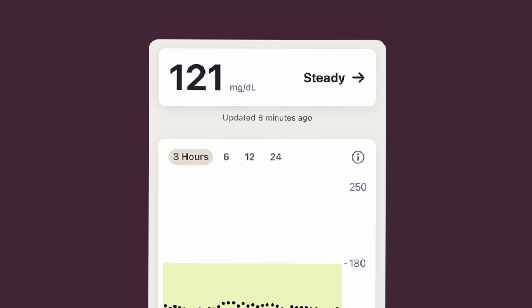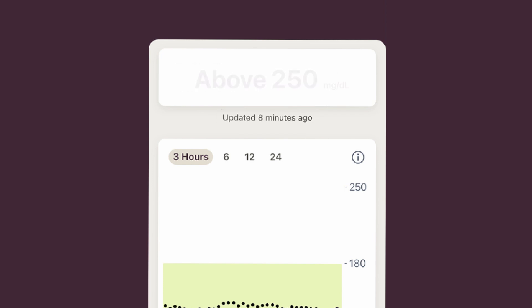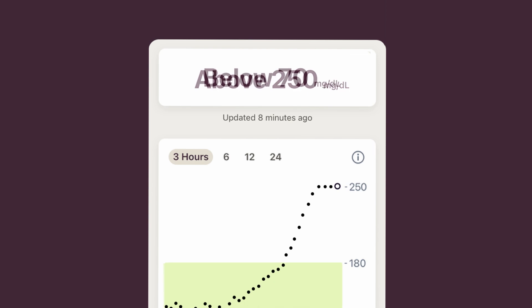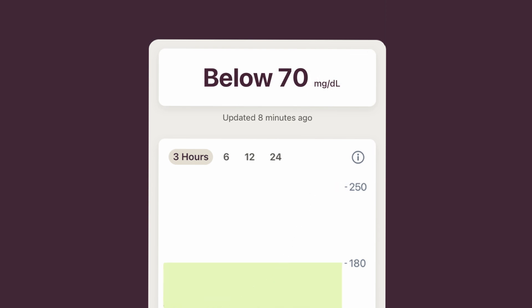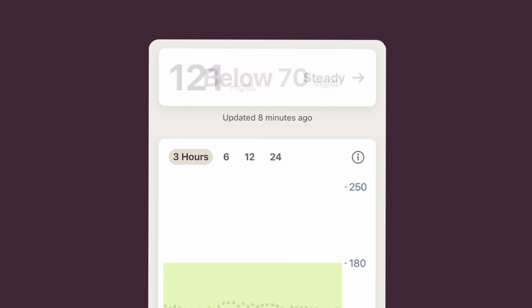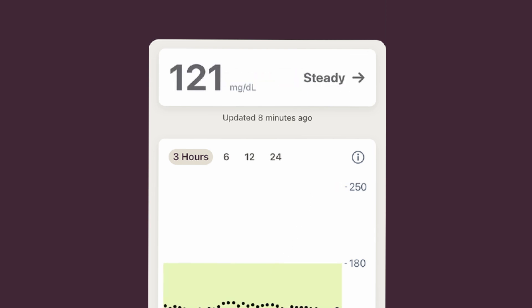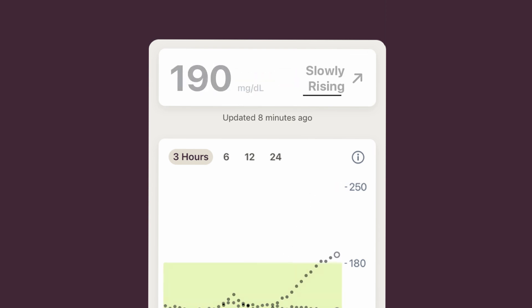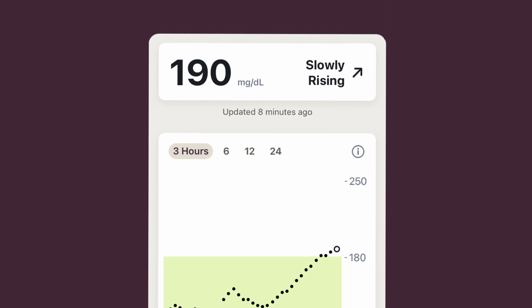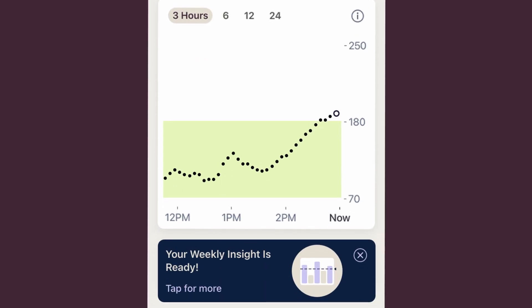Sometimes, you may not get a number. This means your readings may be above or below the trend graph. Since your glucose is always changing, the trend arrow is really important. It shows where your glucose is heading and how fast it's moving. Arrows can help you avoid being low or high by prompting you to take action ahead of time.